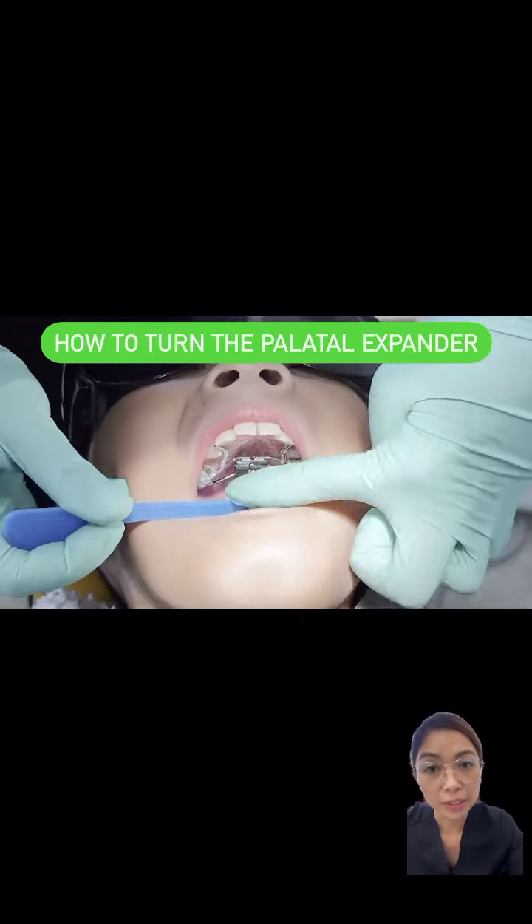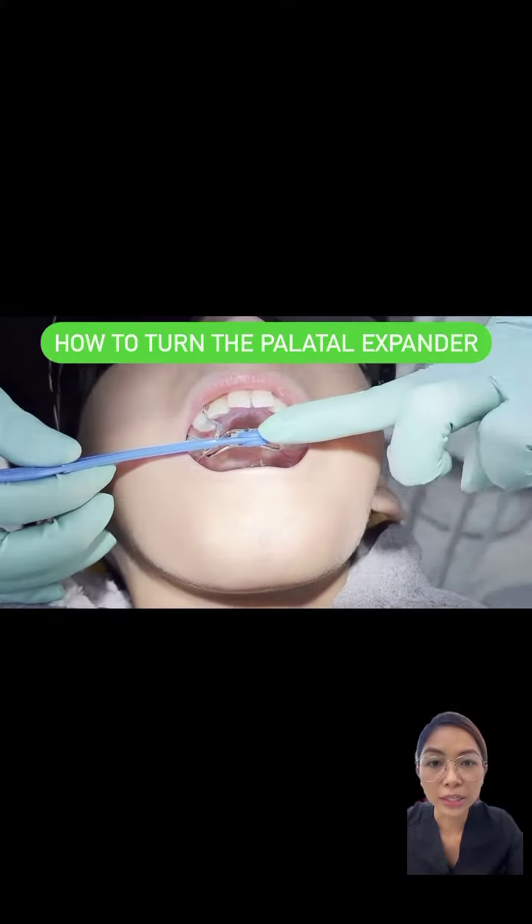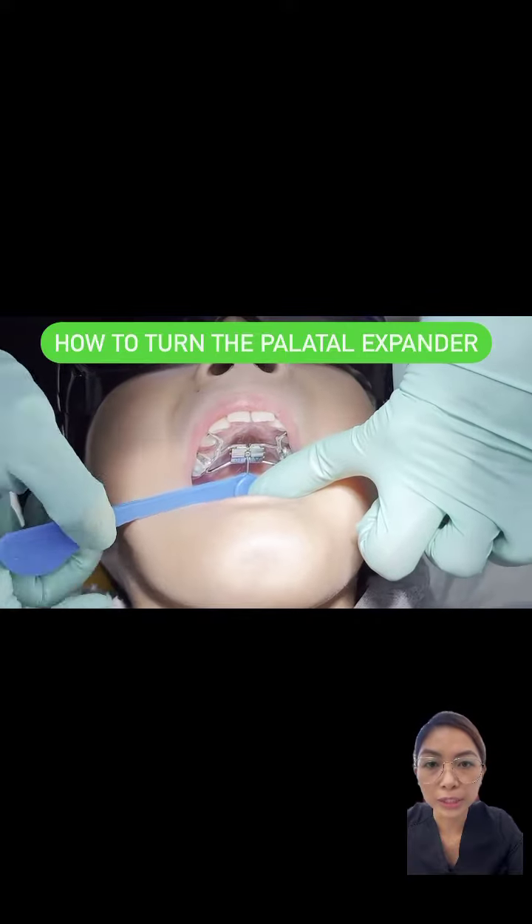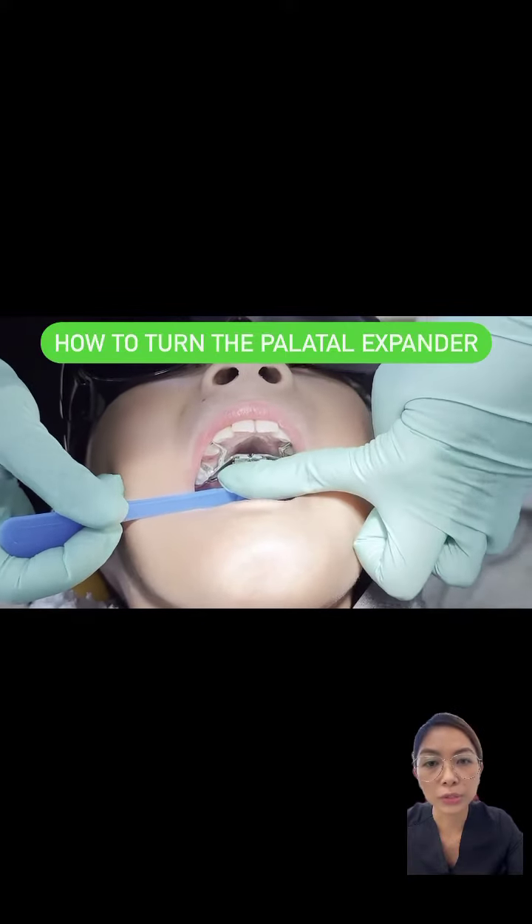Once you feel the stop and you see the next hole, then gently push the key downwards. Just make sure that you don't push the key forwards as it will undo the turn.